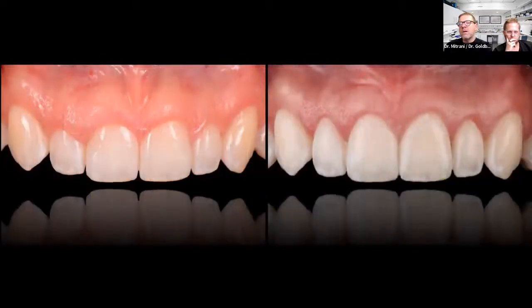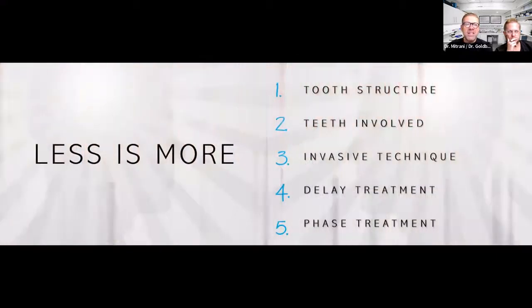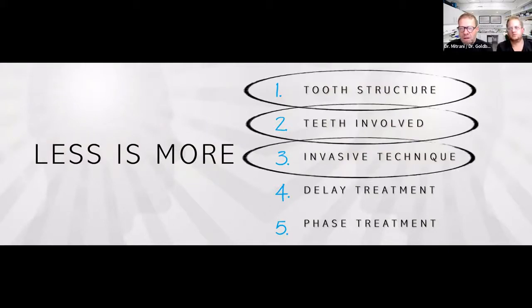So when you think about what was this patient's journey and how this connects with that so-called less is more philosophy, you'll notice that for this particular patient, we're able to score in the 3 different aspects. We are preserving all tooth structure. The teeth involved were only those needed, and we utilize the least invasive techniques, both with laser and of course with bleaching, and we attained the best possible results. And we have an incredibly happy patient, a patient that becomes a raving fan of the practice because she leaves the practice saying, wow, I didn't even need to go through the veneers. I'm happy with the way things turned out.